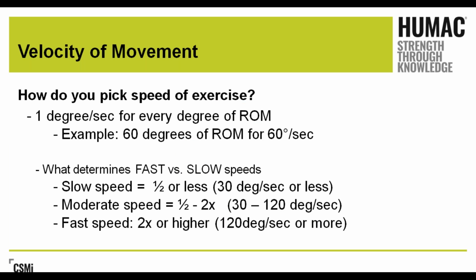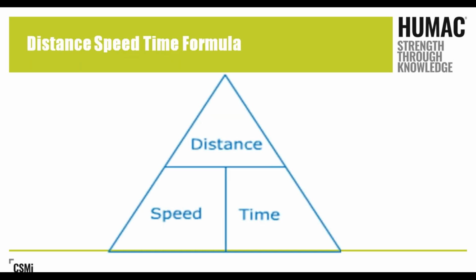Do we go faster than that? With very select patients, we may. But when we start going down to quarter-second decelerations, we're talking about someone that we've been training on this technique for a long period of time, and that we're really trying to get back to a very high level of physical activity, much like they're going to find on the field when they're running the 100 meters in 10 seconds, when they're able to pitch at 90 miles an hour. So we need to be able to adapt our patients back to what they're going to be performing on the field and be able to train the muscle to perform correctly.